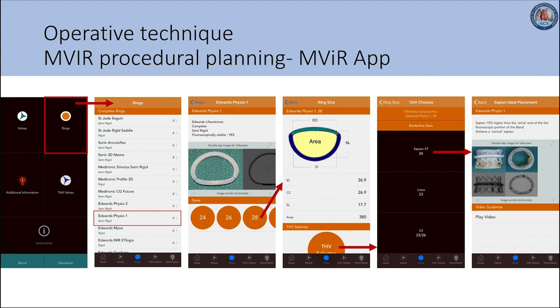This slide demonstrates the functionality of the Mitral app for mitral valve-in-ring. Once you open the app, you can click on rings and select the ring of interest. Here we have selected Edwards Physio 1 as the example, which opens a page containing important dimensions as well as the transcatheter heart valve selector providing suitable TAVI options. If you select Sapien XT, information regarding placement and deployment is available alongside a video to supplement guidance.